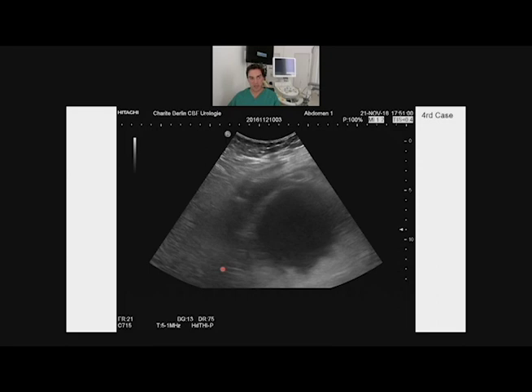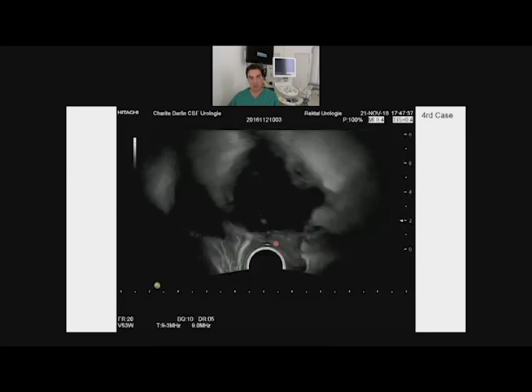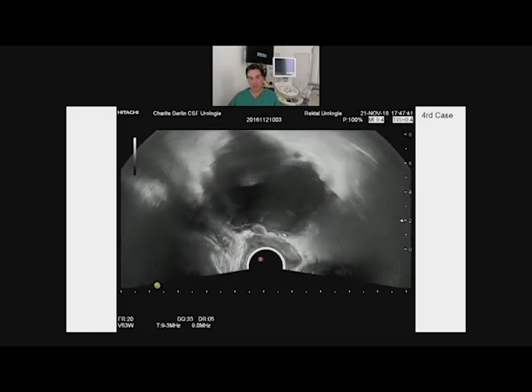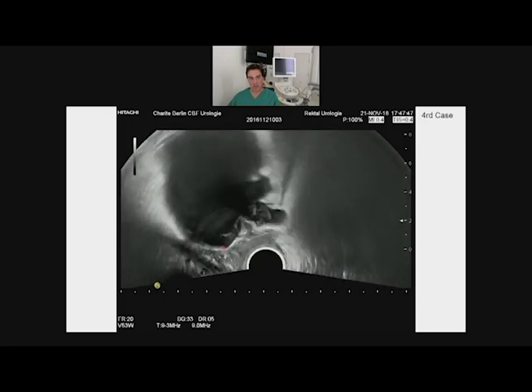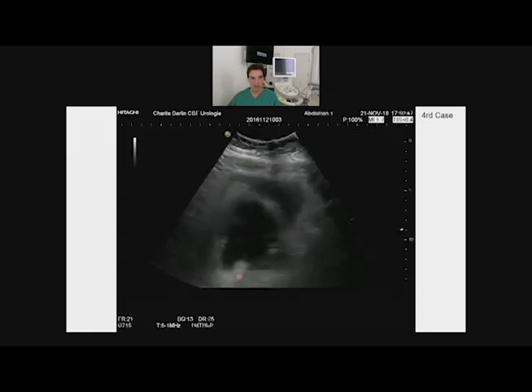You see a big urinoma. You see the end of the ureter, the bladder in the frontal side. The kidney produces a little urine and a little hydronephrosis, but you see a big urinoma. What they did now is that they cut the ureter. In ultrasound, you have a chance to see where it is cut. This is the ultrasound transvaginally, and you see here the end of the ureter and the end of the ureter nearby, beside the bladder.